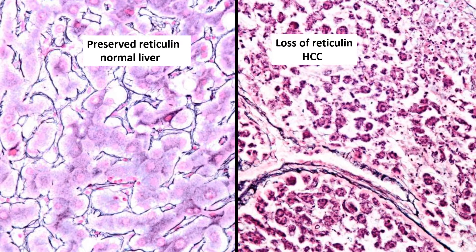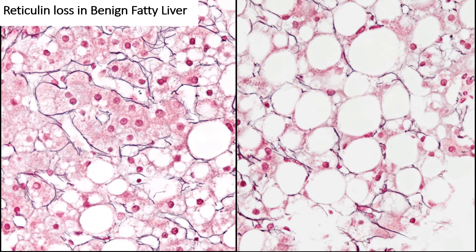Here's another important feature: the reticulin stain. This is what normal liver looks like on a reticulin stain. About half of HCCs show loss of the reticulin framework, and when you see that loss, it is essentially diagnostic of HCC. But remember to look for a positive control. It's not uncommon for the stain to fail — if it does, repeat it. One important caveat: when you have a very steatotic liver, the reticulin fibers get disrupted, so this rule does not apply to steatohepatitic or significantly steatotic livers.